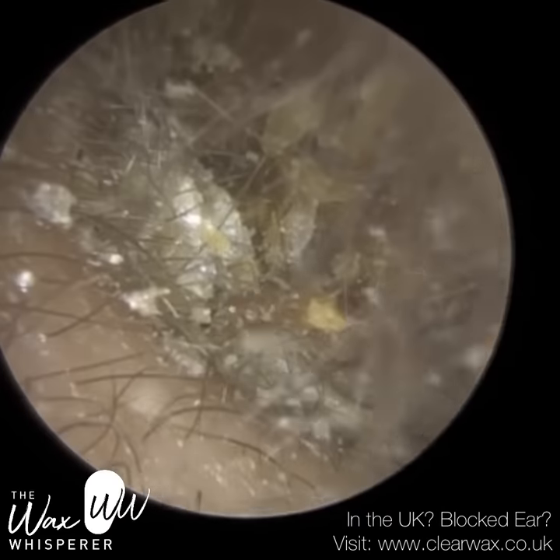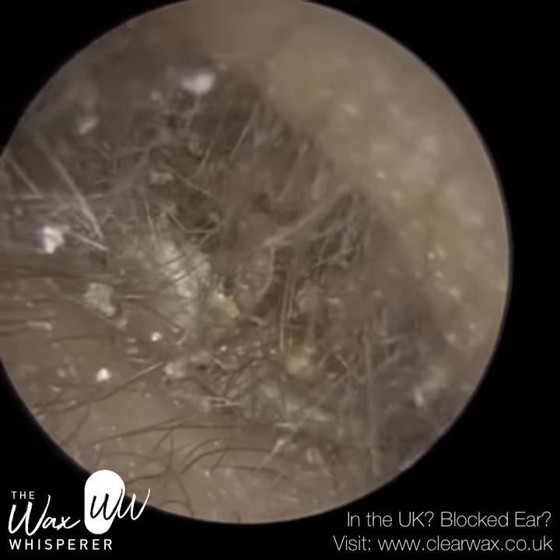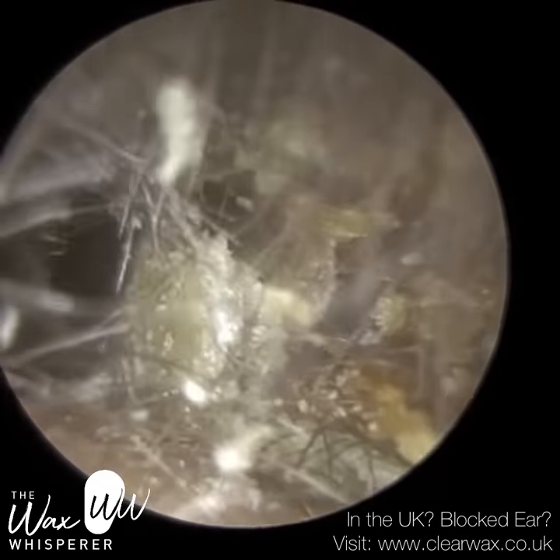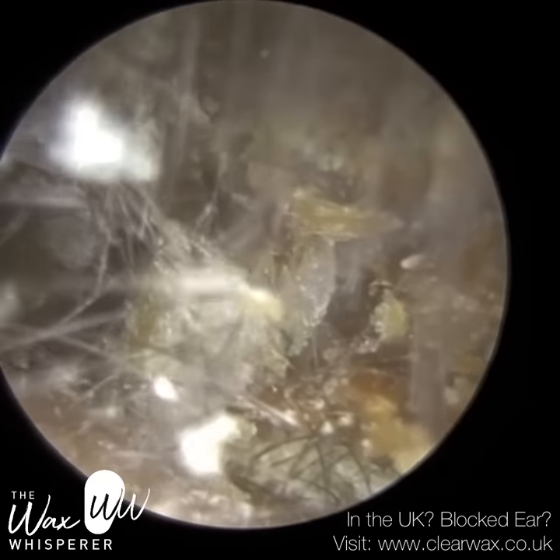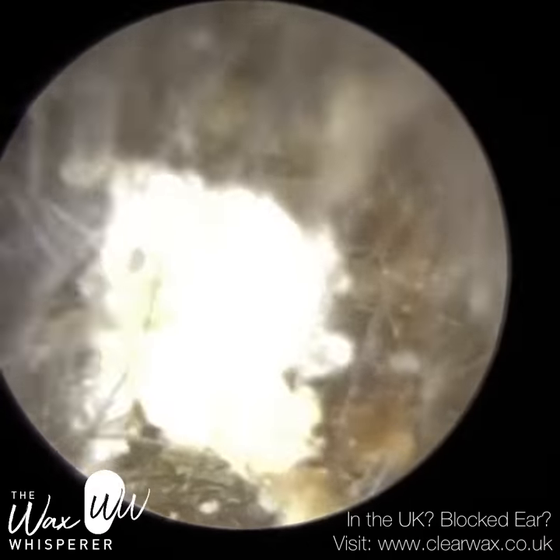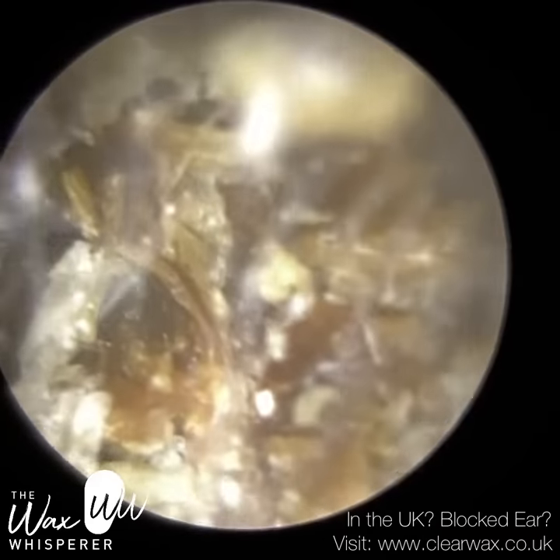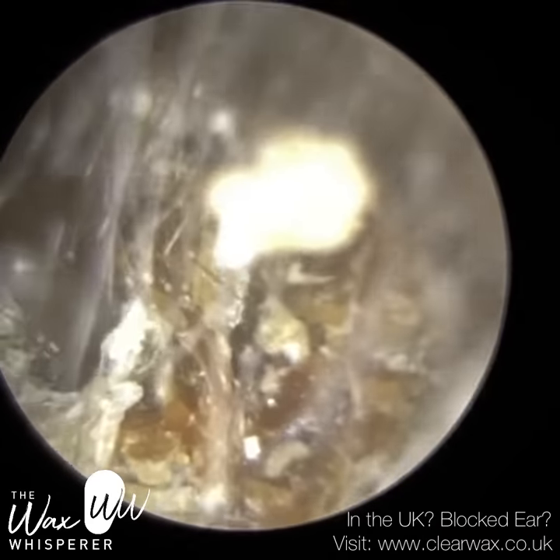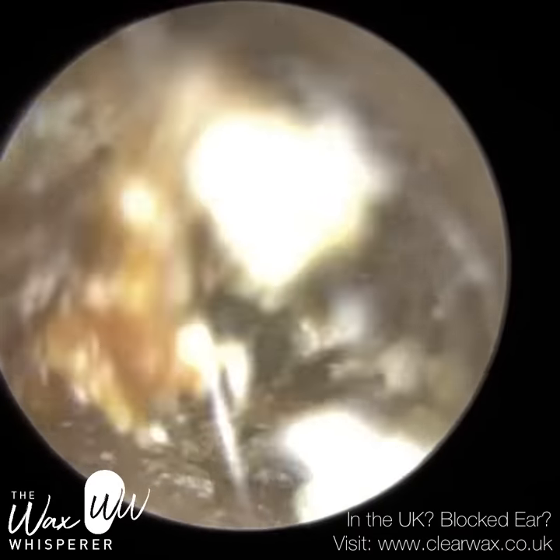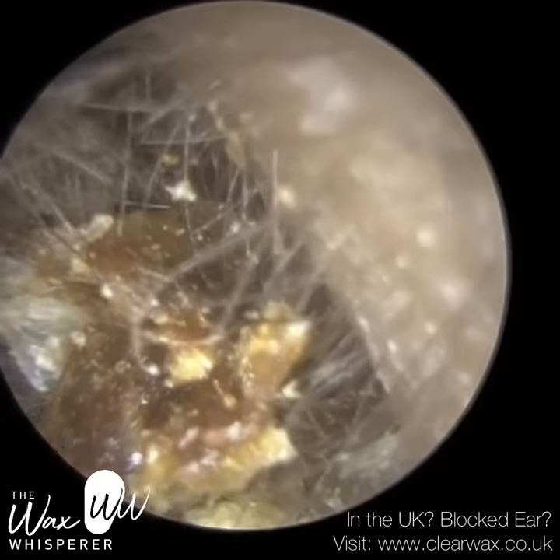They do ironically work for a large high street chain that offers earwax removal, but they wouldn't attempt to remove this from the patient's ear without the patient using some earwax softening drops for at least a week. The patient really doesn't enjoy using the drops and therefore they were recommended to see myself. As you can see, the patient's not using any drops — it's really dry wax, it's not been softened at all.